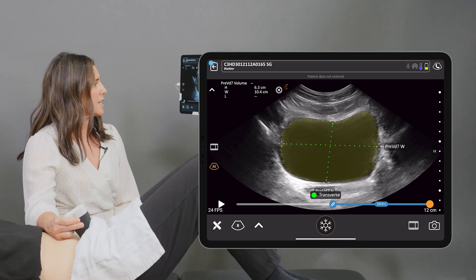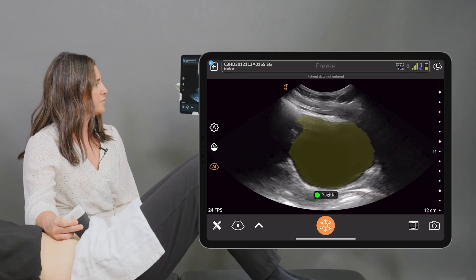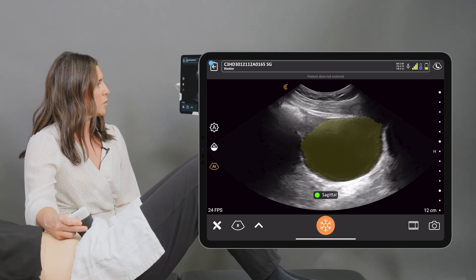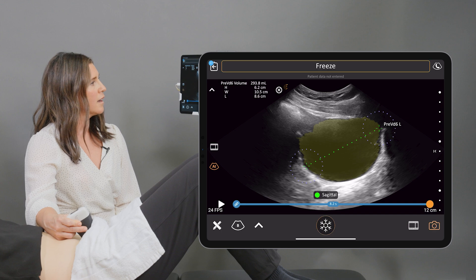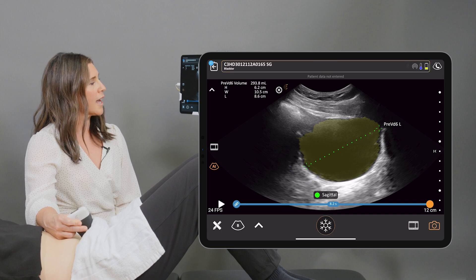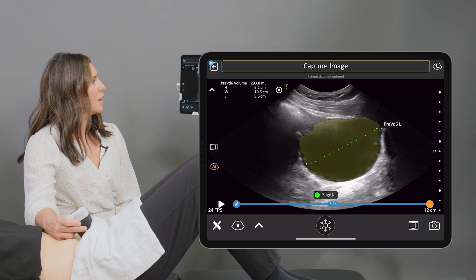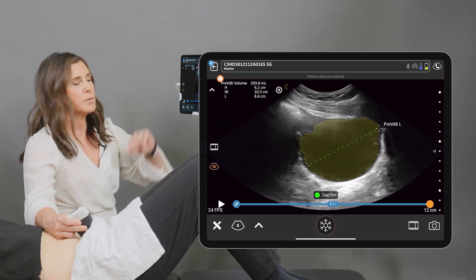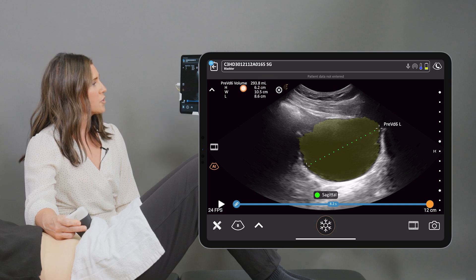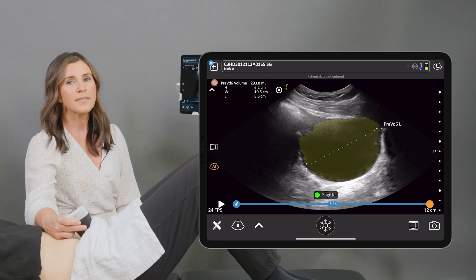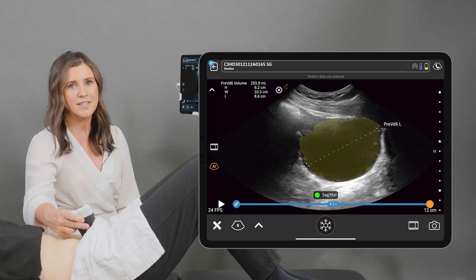We're going to unfreeze the image, and again we're going to freeze and capture the image. You're going to see the bladder volume in the top left corner of the screen, and that wraps up bladder volume measurements.